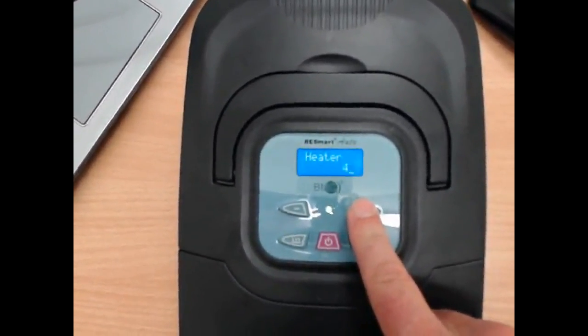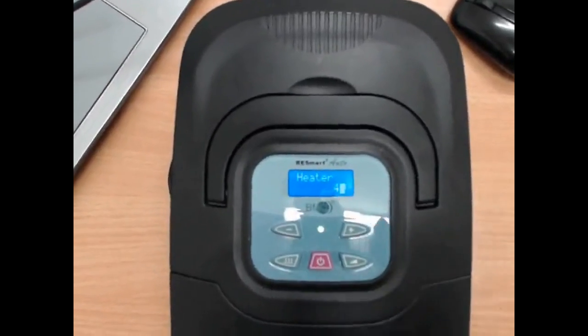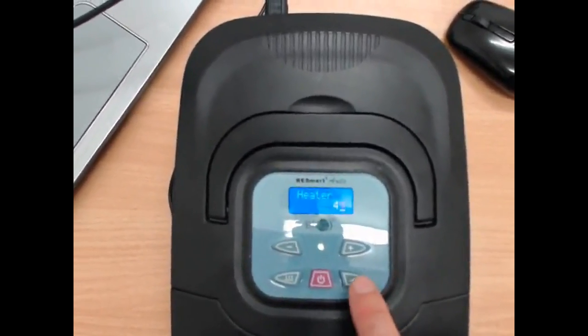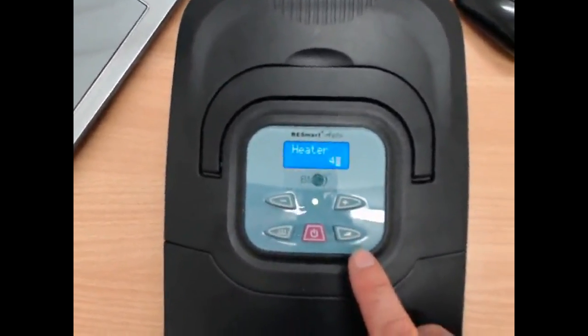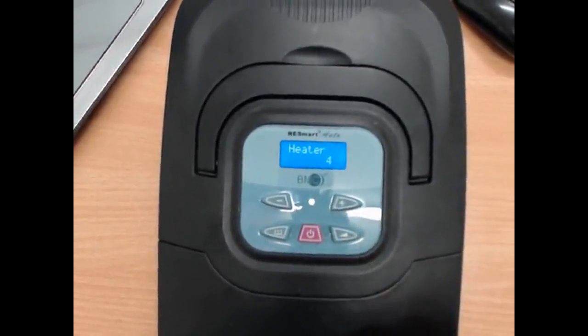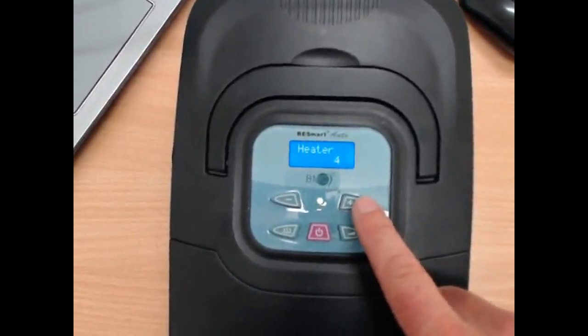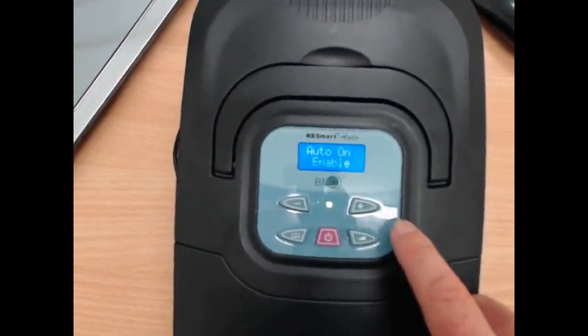Just try these things out, see what you like. It's very easy to do. Try 3 on one night, 4 on the next, 5 on the next, and see how you find that. So once we've got the number that we want there, what we want to do is just hit this button again, the little triangle button, which then locks it in. Alright, now we can press the plus button, and now it's not going to increase that number, it's going to actually take us to the next setting.